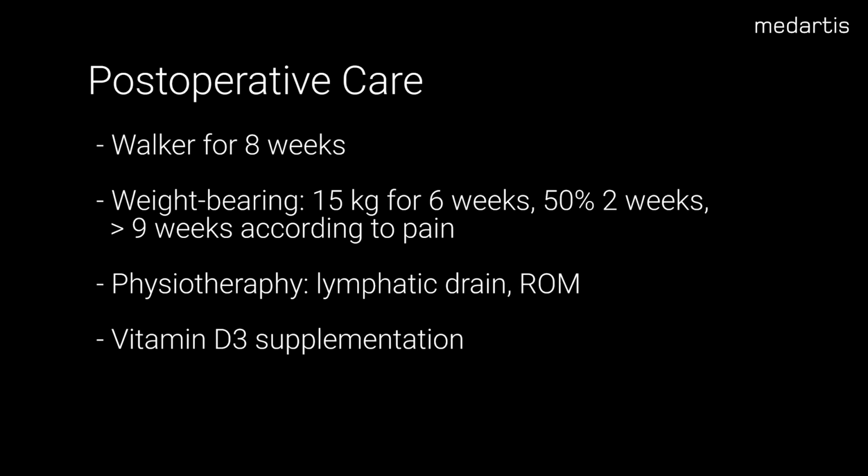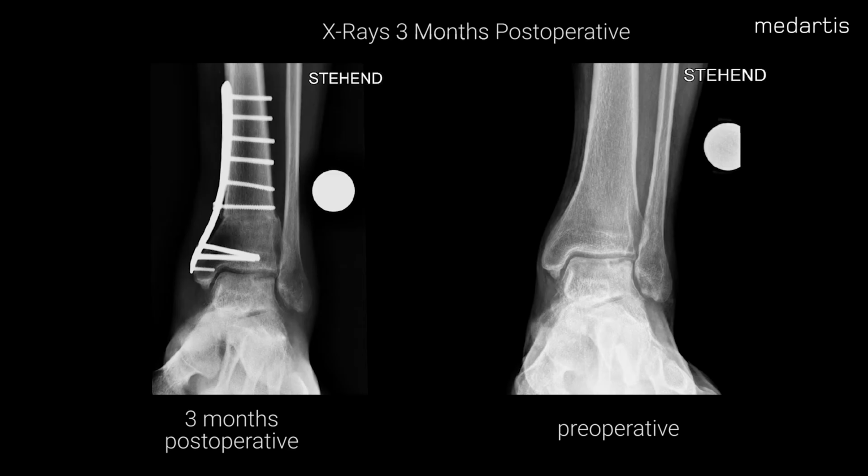Early physiotherapy is focused on swelling control and range of motion. Vitamin D3 supplementation is recommended. The 3-month post-operative X-rays show a healed osteotomy with a successful deload of the lateral arthritic ankle.